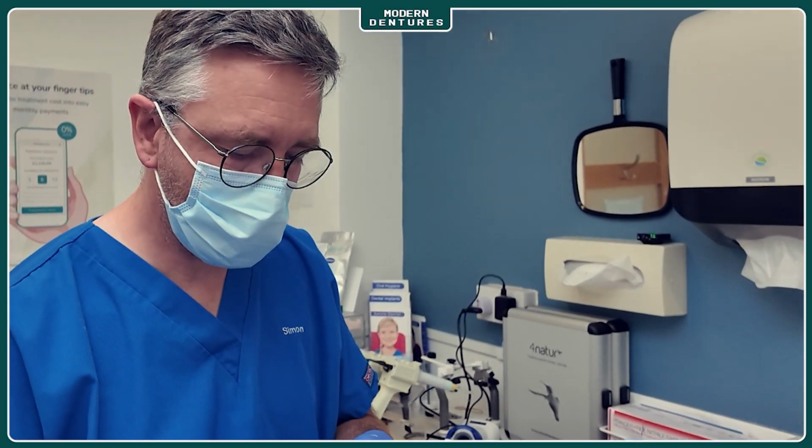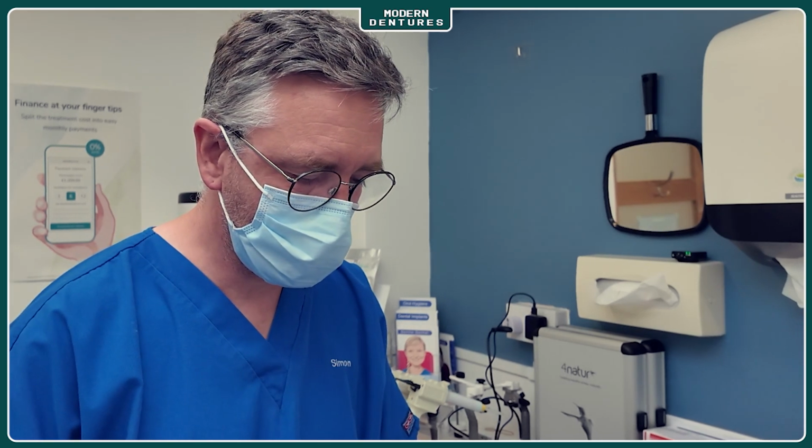When I'm loading the lower tray, it's better to overload it than underload it.